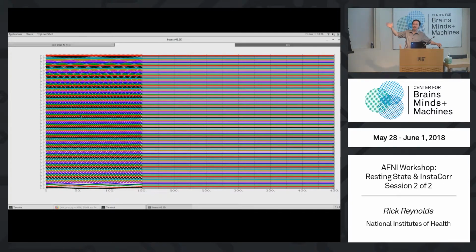So you can put these in a linear regression and get rid of them that way, and it's identical to doing band passing. We have 3 runs, so we do band passing per run. The band pass terms do not cross the run breaks, so we keep the band passing separate per run, because BOLD effects don't cross run breaks, so you want to do these separately across the runs.